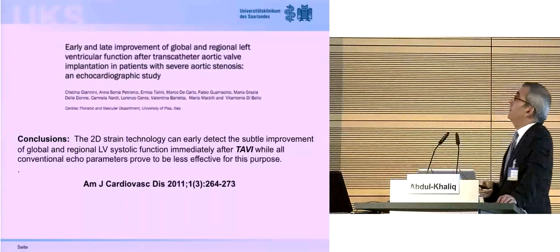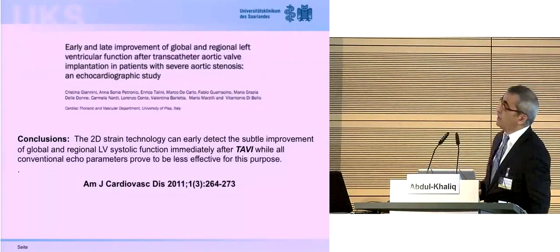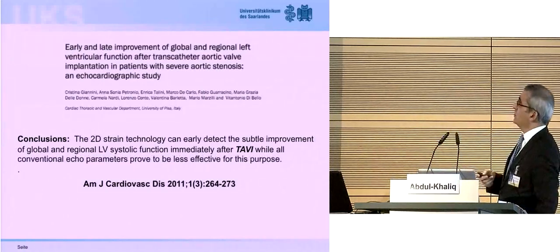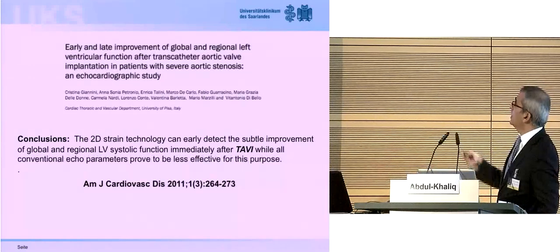And these studies showing the rapid improvement of myocardial function in those patients receiving aortic valve replacement by TAVI.